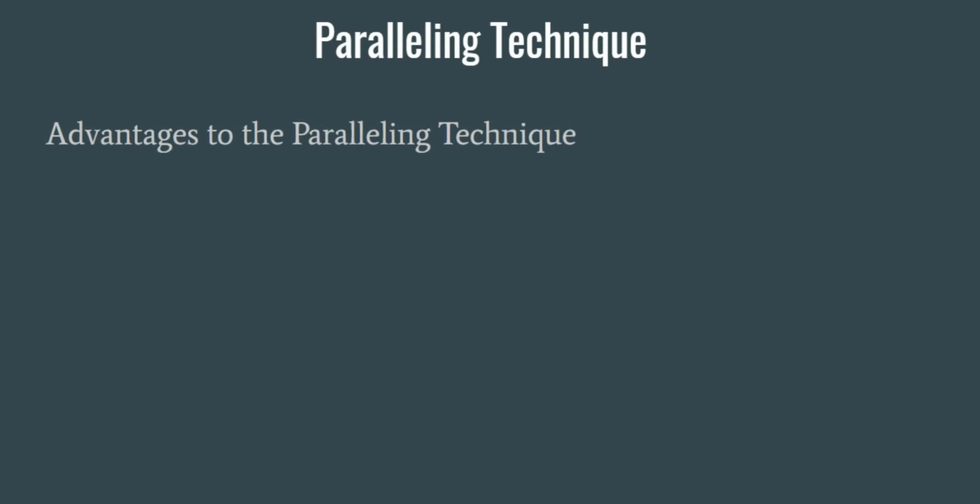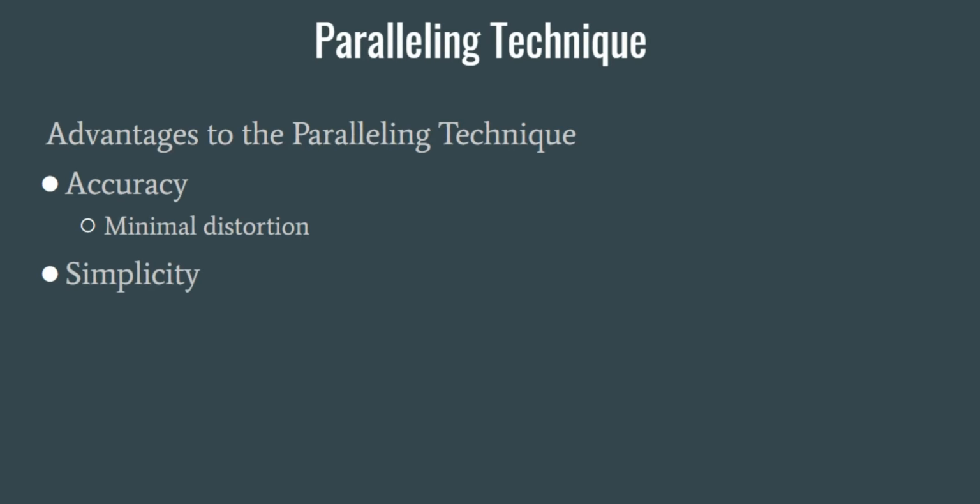Some advantages to the paralleling technique. It is accurate. It has a high rate of accuracy. The image is very close to representing what the actual tooth looks like, and there is very little distortion, and it has dimensional accuracy. The simplicity of it. It's simple and it's easy to learn and it's easy to use.